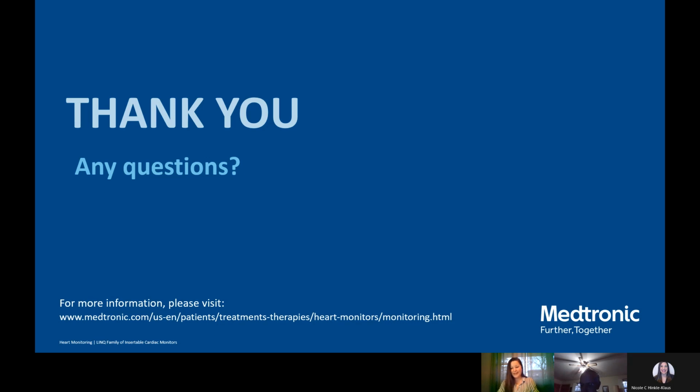Yes, you're fine to play an electric guitar. Fortunately, it does not interfere with anything, and usually the test is MRIs. That's one of the really hard tests for a lot of these devices to pass. So if you can pass an MRI, meaning you're safe to have one of those, then pretty much everything else on the list is safe, but certainly an electric guitar would be fine. Essentially, it does not interfere with anything. So metal detectors, MRIs, CT scans, X-rays, the list goes on.